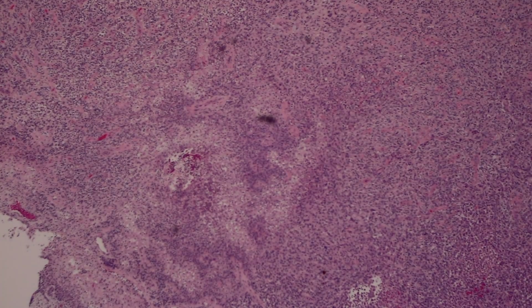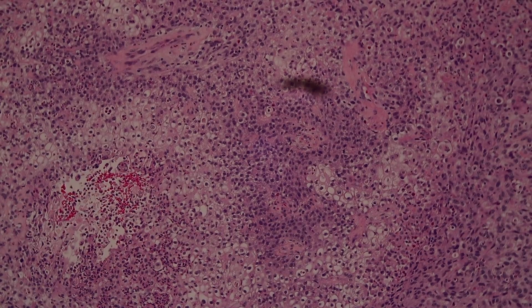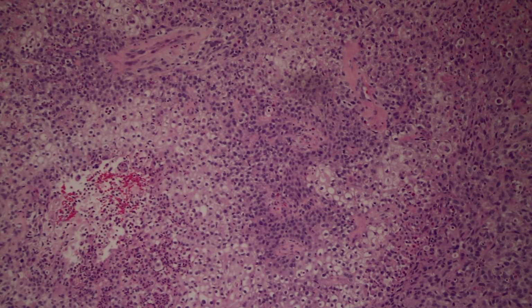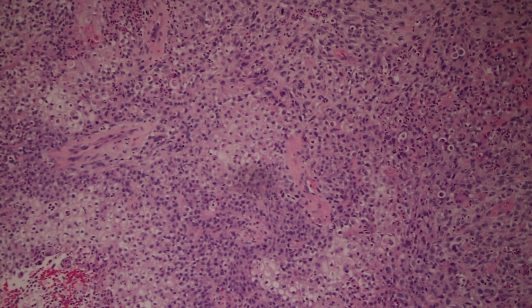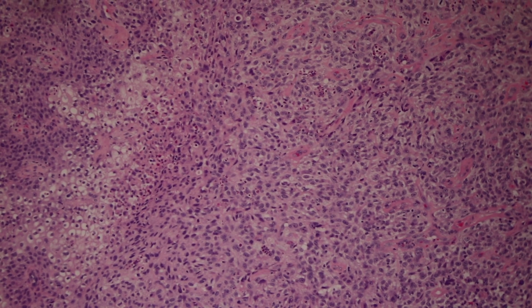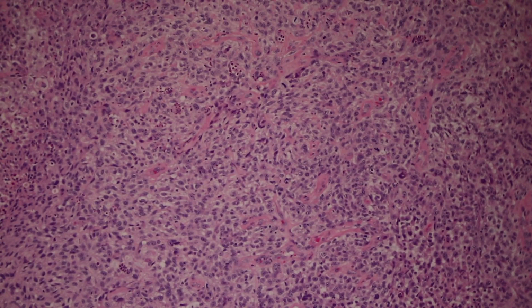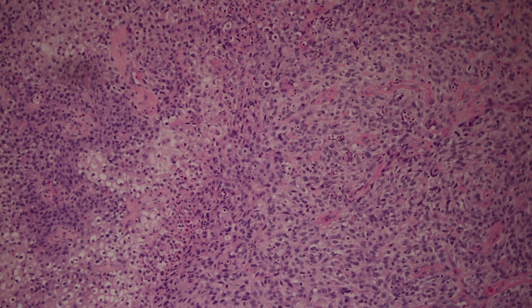Now in this case, we probably can, because if you look over here, what do we see? There's actually obvious squamous cell carcinoma here. There's nests of squamous cell carcinoma that have some kind of glycogenated clear cell change, but definitely this is epithelial here, and then it's transitioning into this ugly sheet-like poorly differentiated stuff. So if you want, you could say that this is a squam that has a sarcomatoid differentiation, or some people use the term carcinosarcoma. I feel like those terms can be a little confusing sometimes, particularly to dermatology colleagues who may not see them very often.